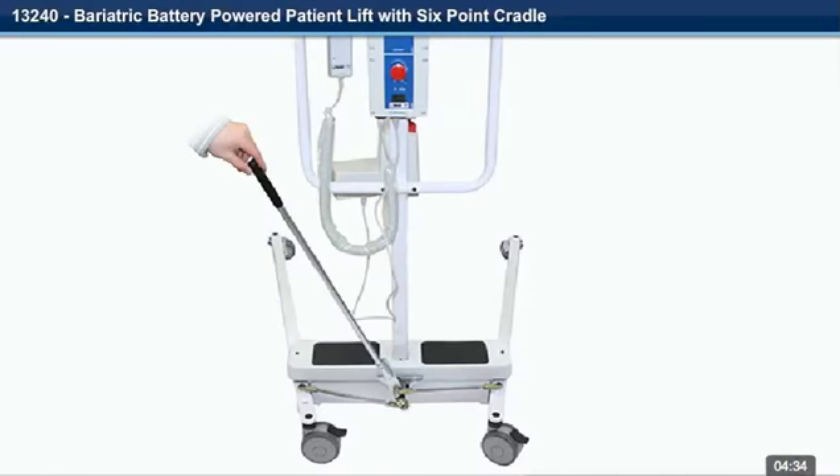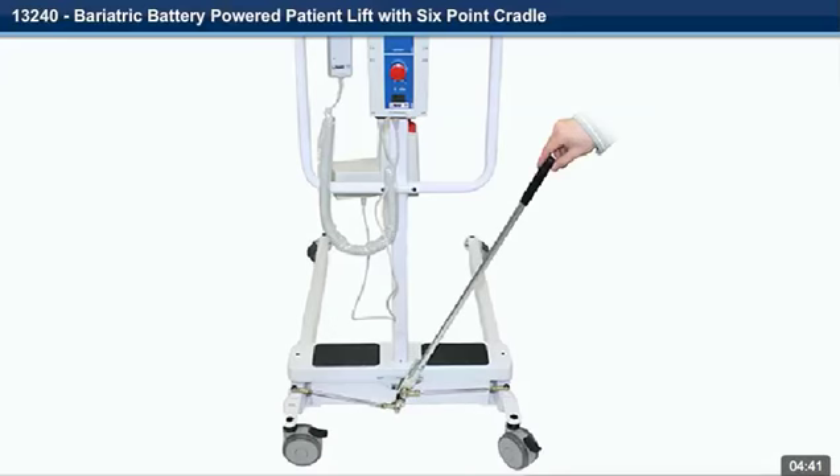Step 27. To spread or close the legs of the lift: pull back on the spreader bar and shift to the opposite side.